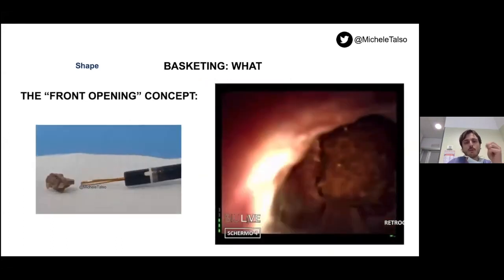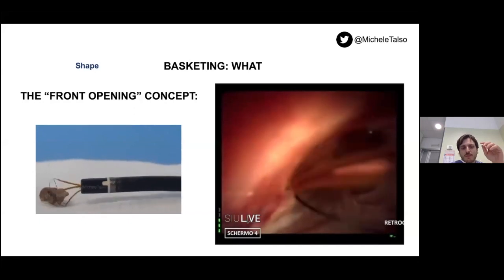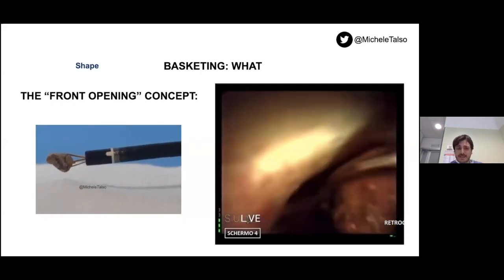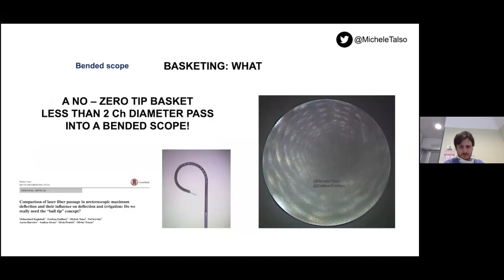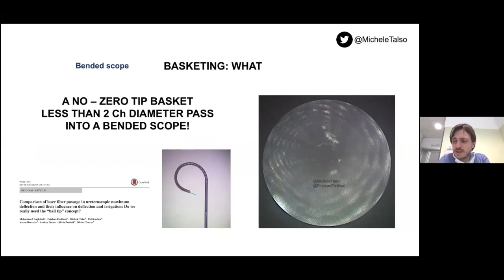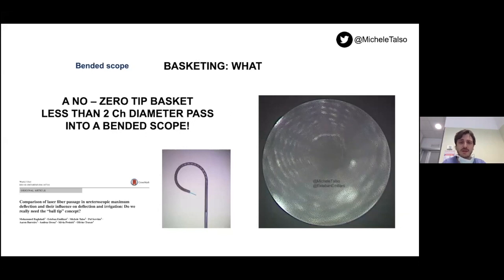Almost all companies are now offering a new front-opening basket concept, useful when you have a stone in a calyx and don't have enough space to pass beyond the stone with your basket — you can approach the stone directly in front of you. The no-tip zero-tip basket with a diameter less than 2 Charrière can pass into a totally deflected scope. We demonstrated this in Paris with Dr. Esteban Emiliani — this kind of basket can pass in a 270-degree deflected scope without any issues, which is really useful to know.